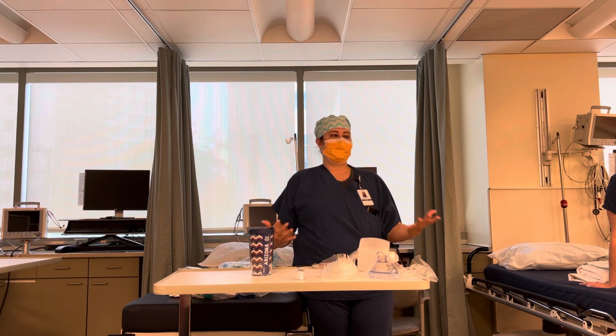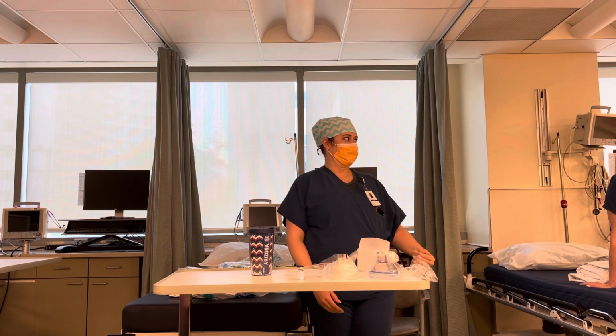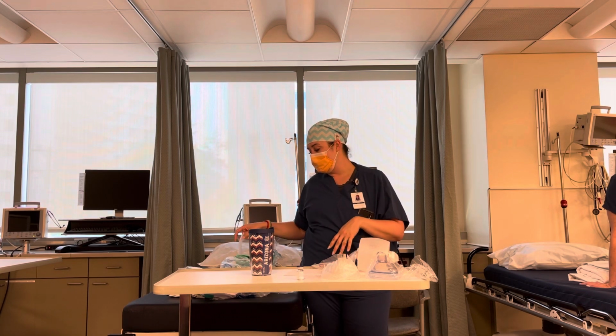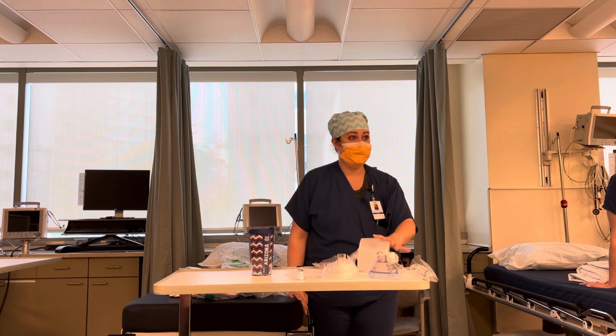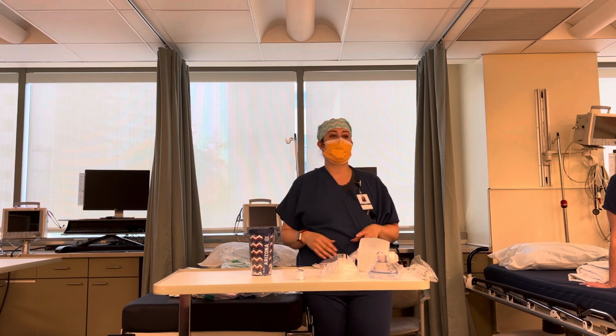So I think ambus are really just best for code situations where they're not trying to do anything. You're just helping give breaths. But this is by far what we'll ask for the most. But we also have ambus. So I just want you guys to play with them, pull them out, get familiar with them.